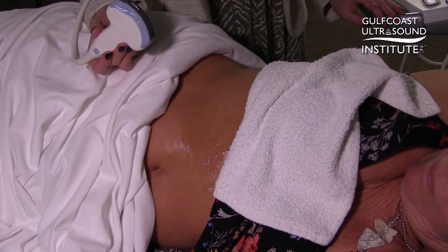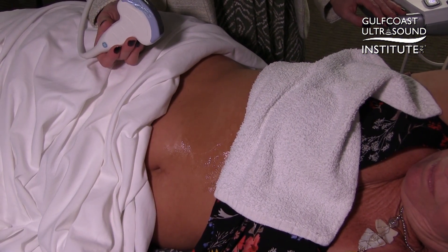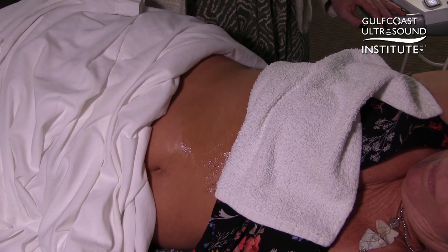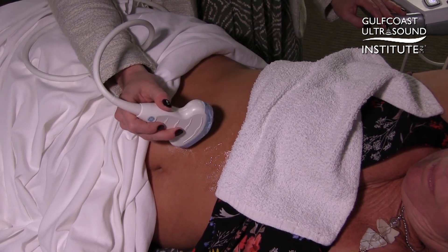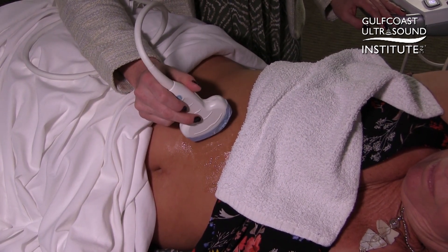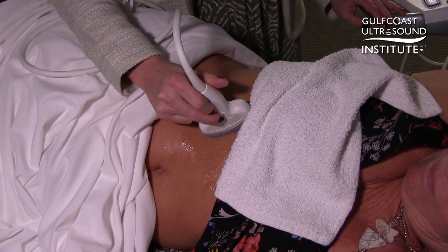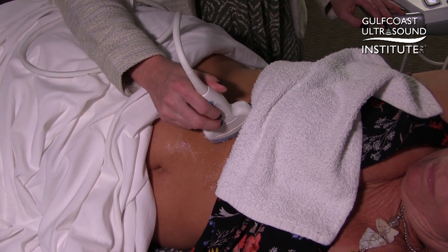First, have your patient roll LLD on their left side away from you. To find the ducts, orient the transducer with the indicator towards the patient's right shoulder and the bottom of the transducer towards the patient's left hip.